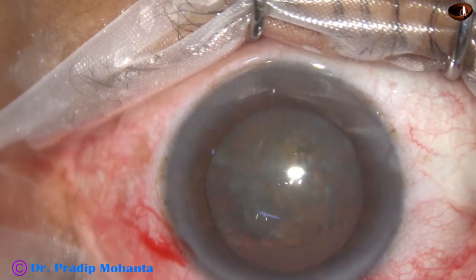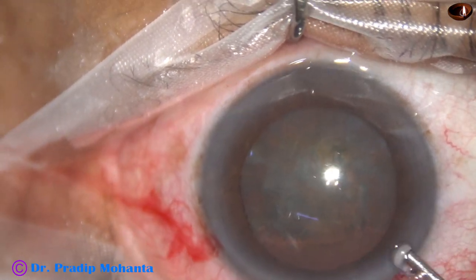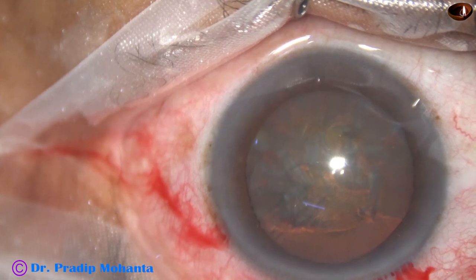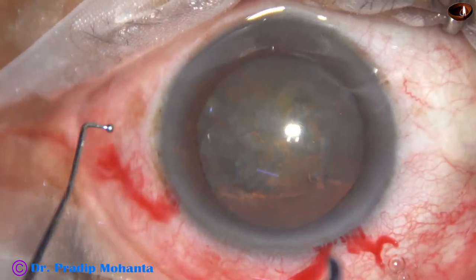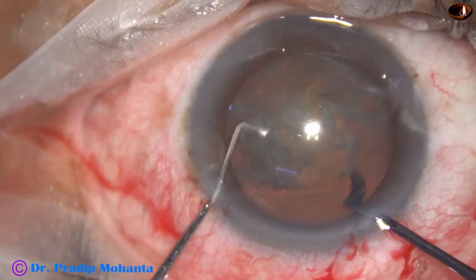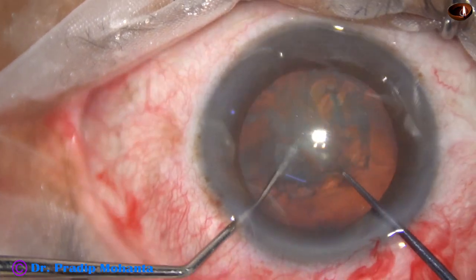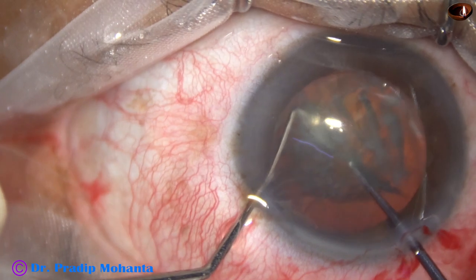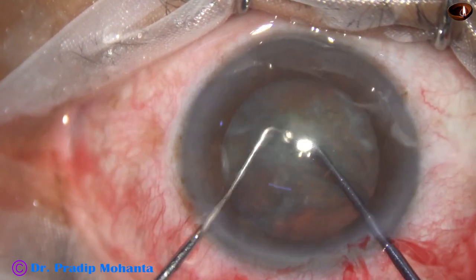I am going to use a pre-chopper to divide this nucleus. Visco first, then the pre-chopper in the right hand and sustainer in the left. And here it goes — the nucleus is divided into two heminuclei.